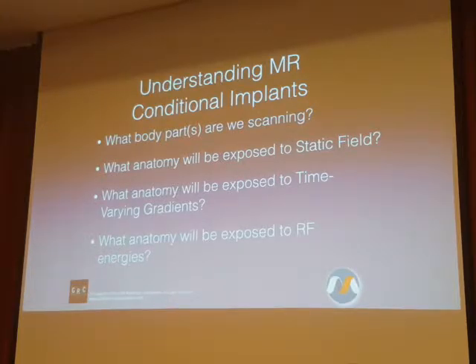The one exception that I'm aware of to what I just told you is cochlear implants. There are cochlear implants that have MR conditional labeling, and the labeling says, by the way, you may follow all of our instructions and the patient may not be able to complete the exam because the exam is too painful for them.